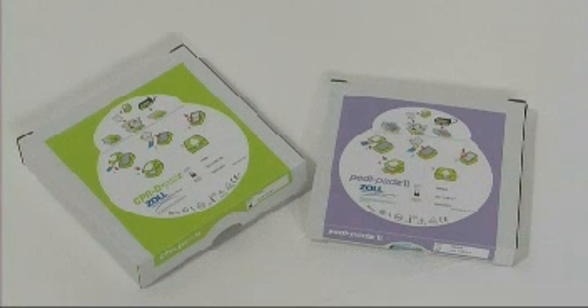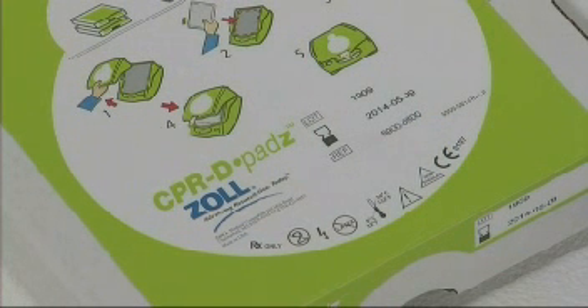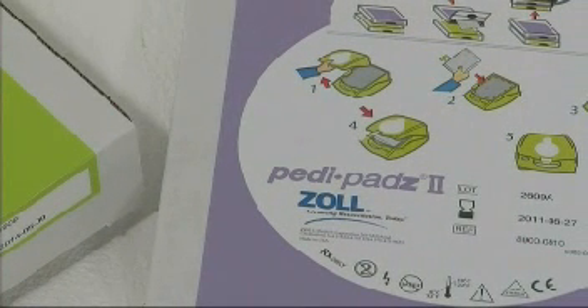Make sure that the electrode pads connected are appropriate for the victim. Adult pads are labelled CPR-D pads. For children under 8 years old or under 55 lbs, Zoll's paediatric pads should be used.